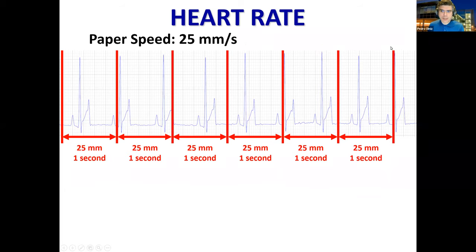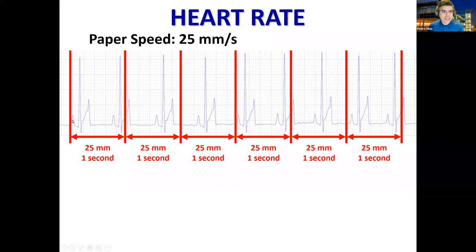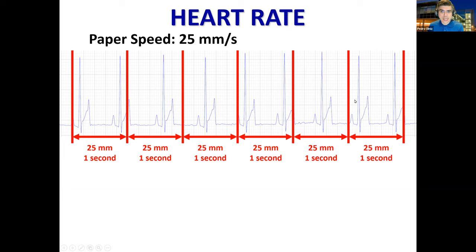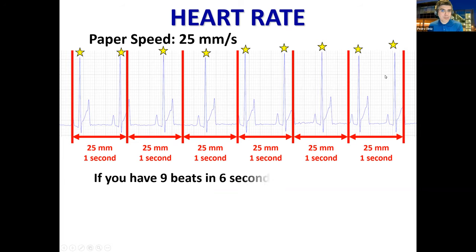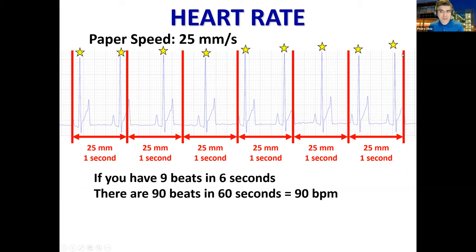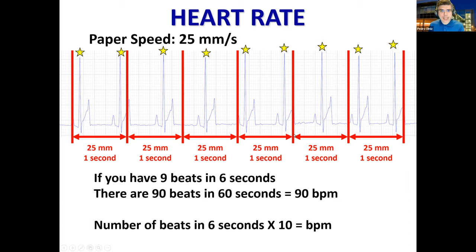Remember that we barely missed the last QRS complex. Depending on where you start and where you end, you might get a different heart rate. If I shift the start by one box but keep everything consistent, I still have 6 seconds but now capture the last beat — giving 90 beats per minute instead of 80. So which is correct? Both are correct; the heart rate varies and ranges from 80 to 90. You still just count beats in 6 seconds and multiply by 10.